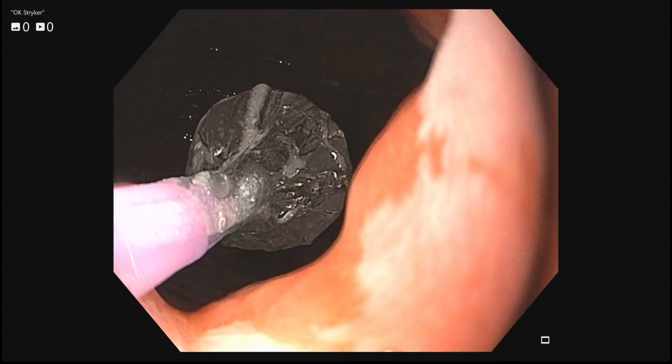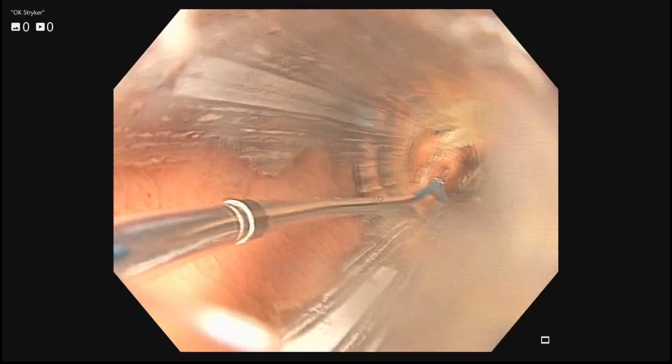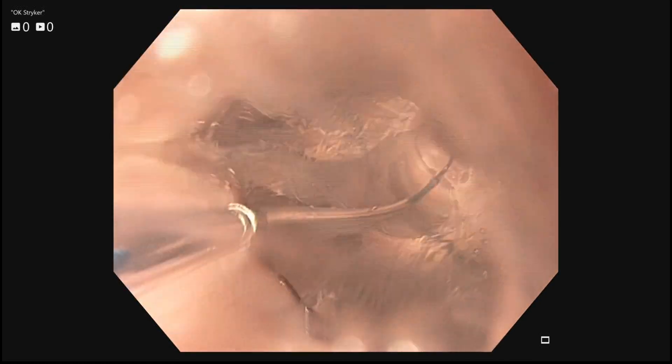Retrograde balloon dilation. The balloon is inflated at the GE junction. Retrograde dilation is performed as shown.